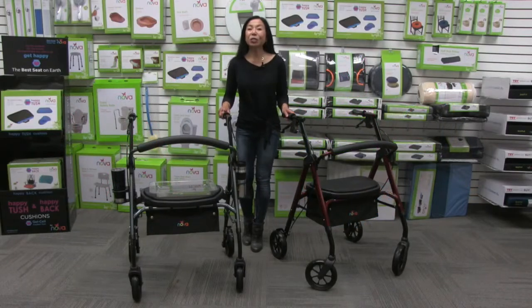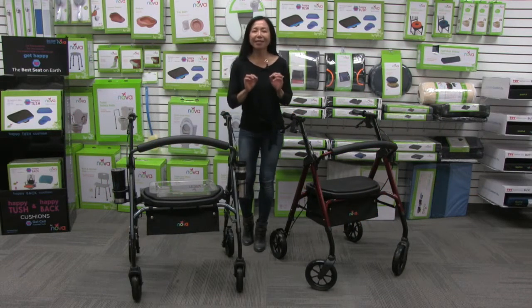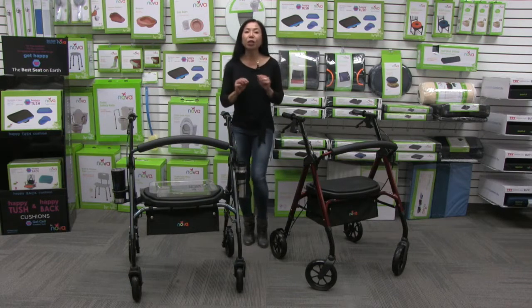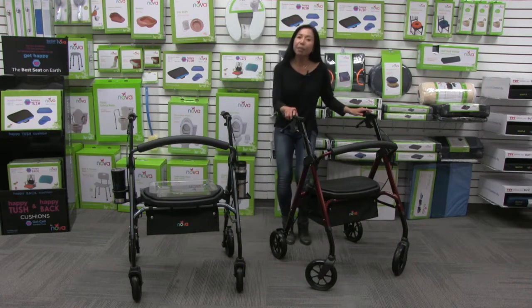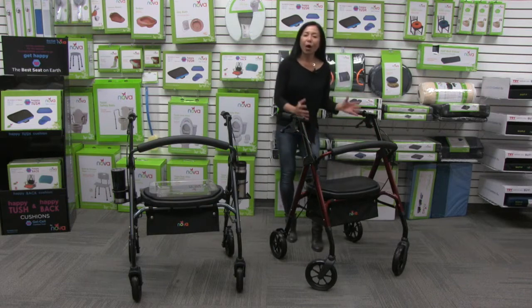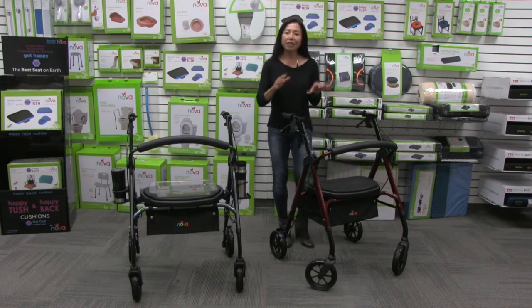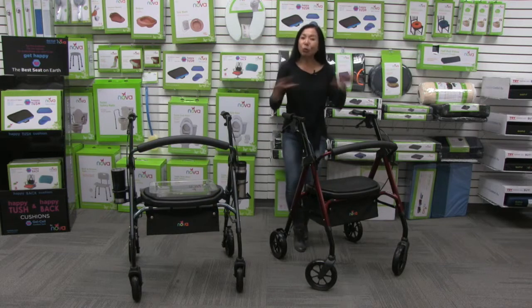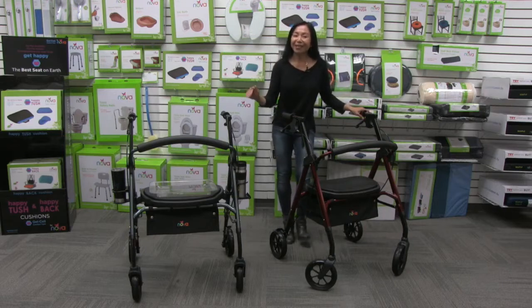This video is about the Star 8DX with an extra wide seat and a 450 pound weight capacity. It's model number 4264. In addition to having a 450 pound weight capacity, we've added four inches in the width, giving it that extra wide seat. It's great for users 5'4 to 6'2 and it's lightweight at only 21 pounds.